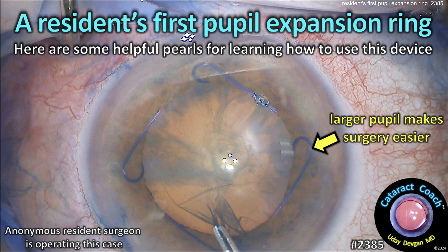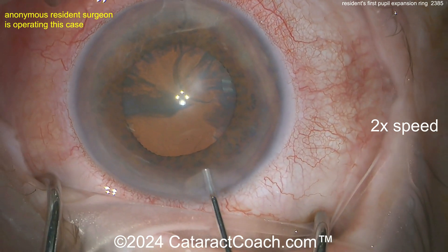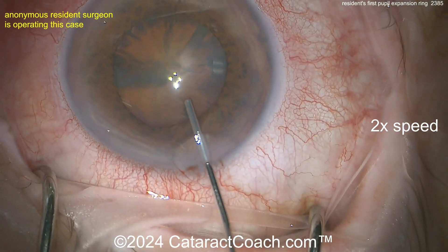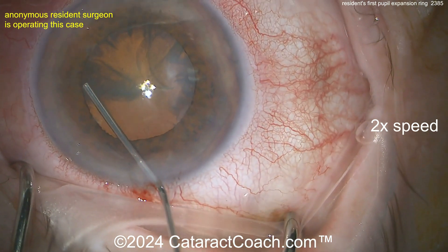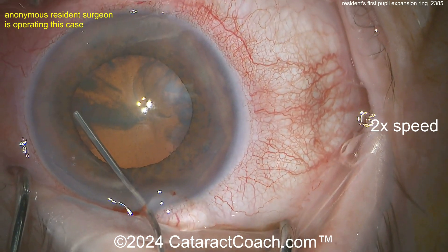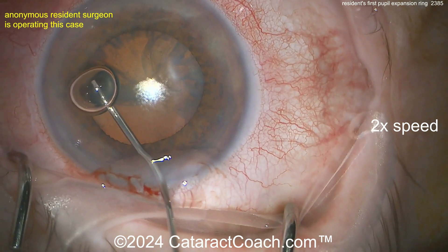CataractCoach.com — a resident's first pupil expansion ring. Here are some helpful pearls for learning how to use this device. A larger pupil is helpful; if you look at this pupil you might think you don't even need a pupil expansion ring — of course you don't if you're an experienced surgeon, but if you're a beginning surgeon it's good and helpful to learn how to use all these devices.